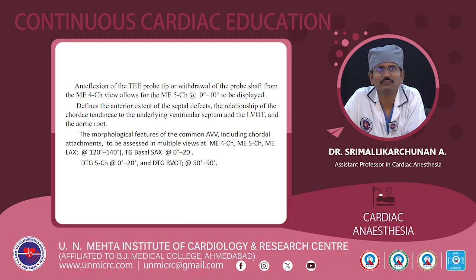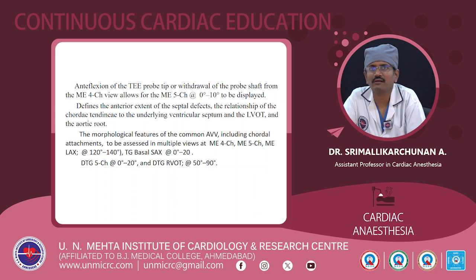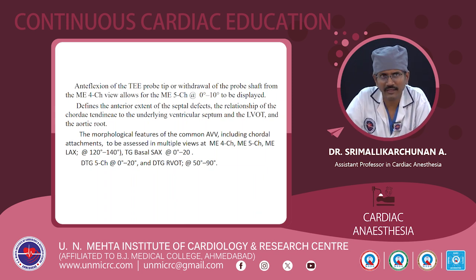Antiflexion of the TE probe tip or withdrawal of the probe shaft from the mid-esophageal four-chamber view allows the mid-esophageal five-chamber view at the angle of 0 to 10 degrees to be displayed. This view defines the anterior extent of the septal defects, the relationship of the chordae tendineae to the underlying ventricular septum, and the LVOT and the aortic root.